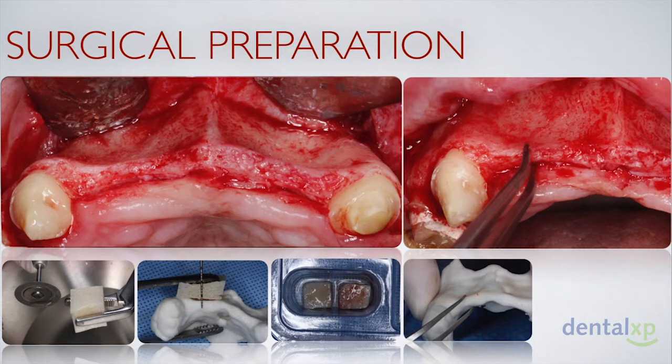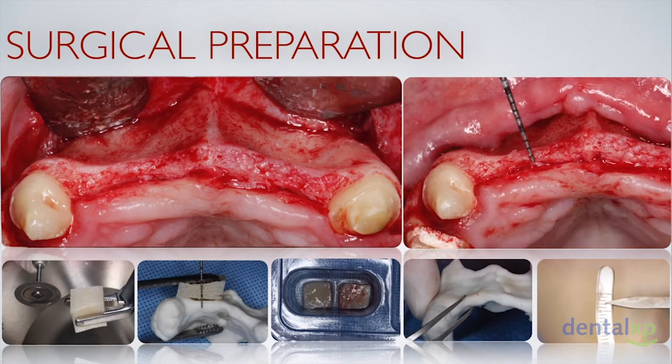And at that point, I was very curious to see the accuracy of those models that I had printed. We took some measurements intrasurgically and outside the mouth on the models, and you can see the differences are quite minimal. It depends mainly on the threshold at which you print these models, but despite these discrepancies, it still gives us a good representation of the morphology of the defect and serves its purpose quite well.